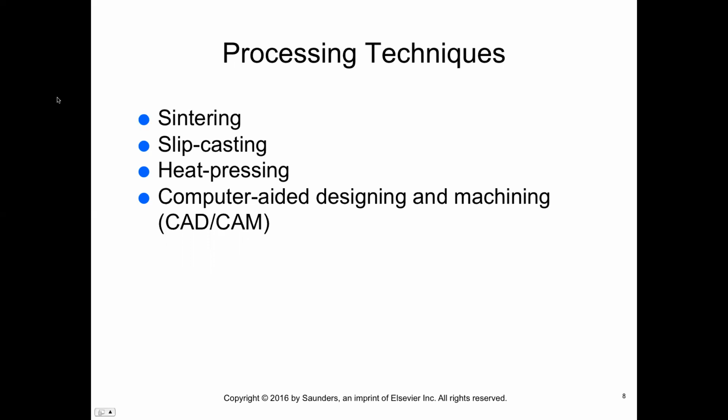This technique can be used with zirconia, spinel-based or alumina-based ceramic materials. Heat pressing uses the lost wax technique, similar to that used to cast gold crowns into an investment mold developed from a wax pattern that was burned out in an oven. We'll discuss the lost wax technique a little more when we get to chapter 16 with the gypsum and wax products.